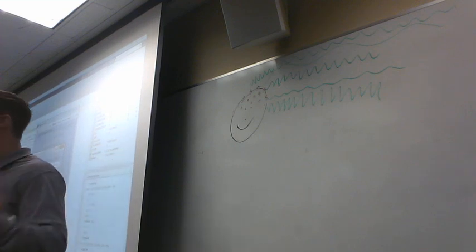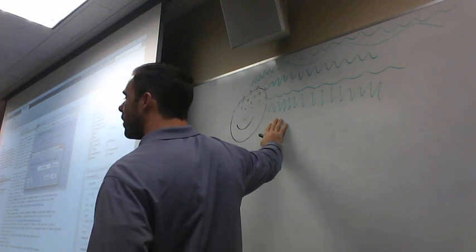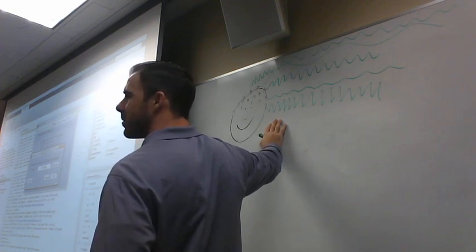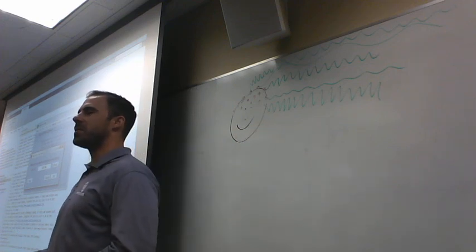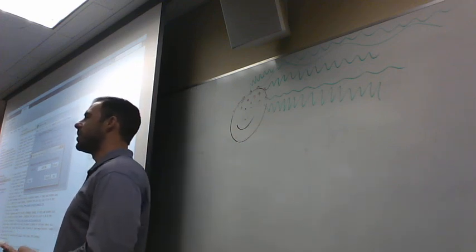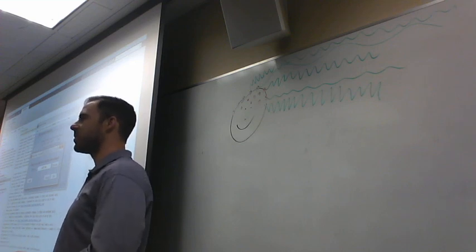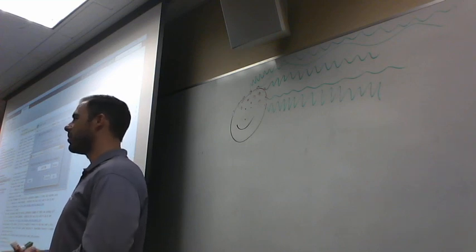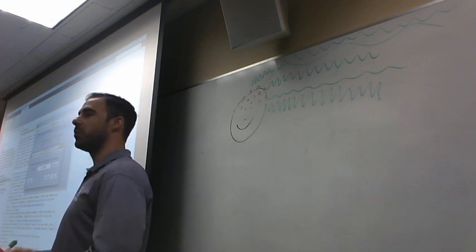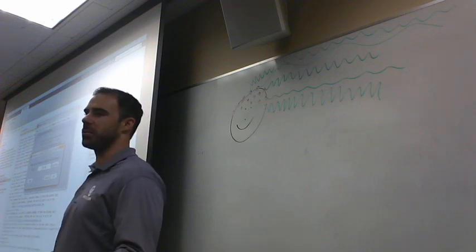So we're recording from our 32 channels, but what does the electrical activity mean? This is a really, really important aspect of EEG and ERP data analysis: in order to have the data be meaningful, it has to be referenced to something. If you're interested in electrical engineering, you might pick up this idea a little easier, but the idea is that we always need a reference. We have to have it in comparison to something.